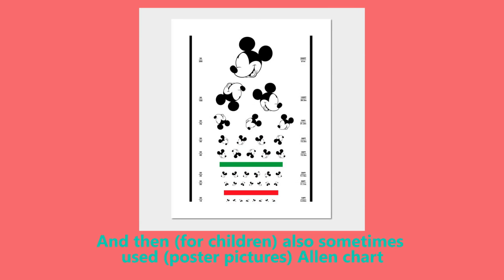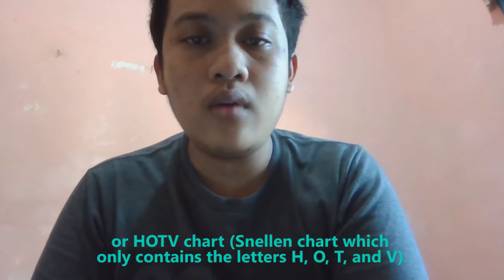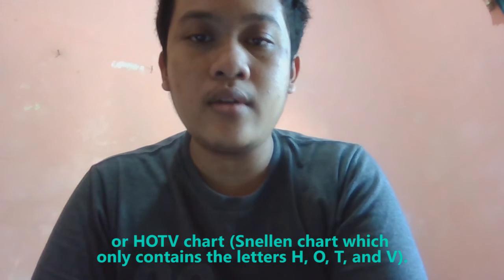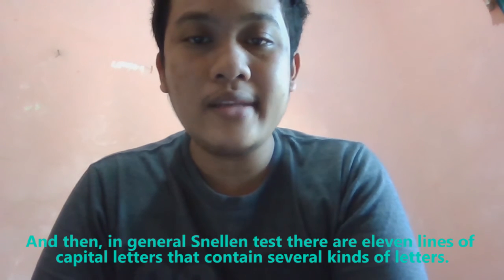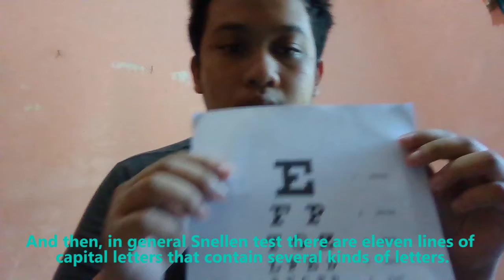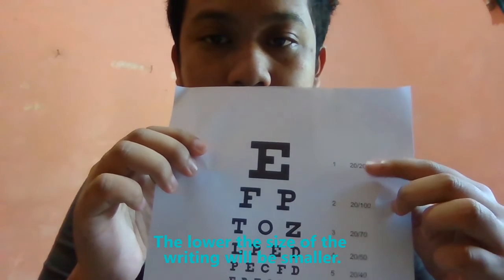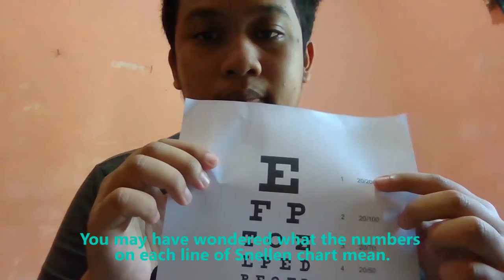And then there is also the Allen chart or HOTV chart. This chart contains the letters H, O, T, and V. In the general Snellen test, there are 11 lines of capital letters that contain several kinds of letters. The lower the line, the smaller the size of the letters will be.